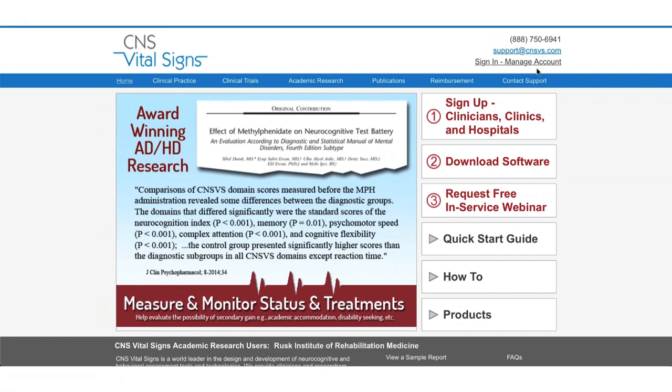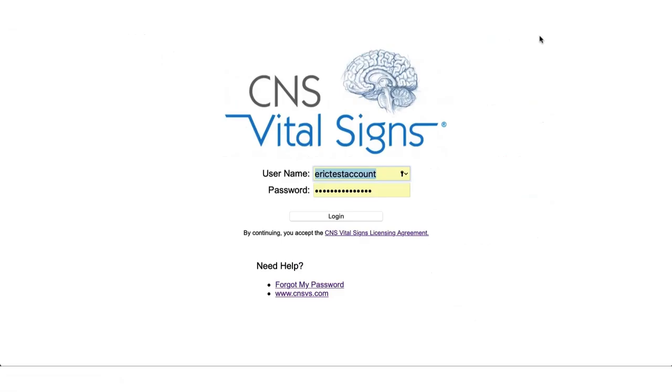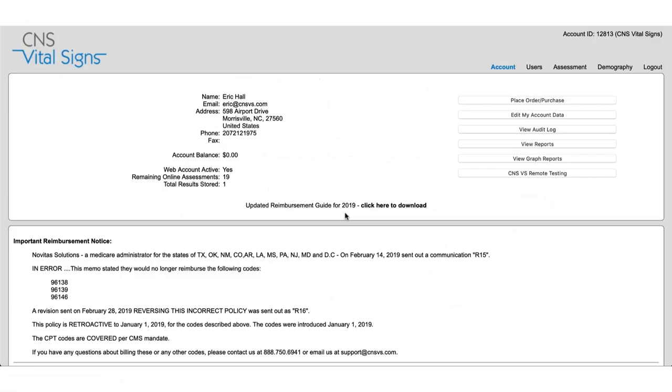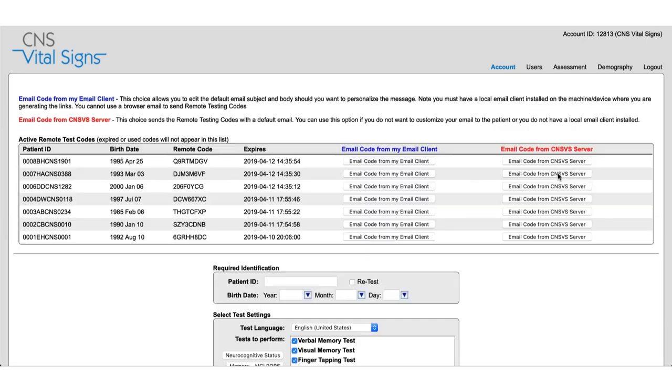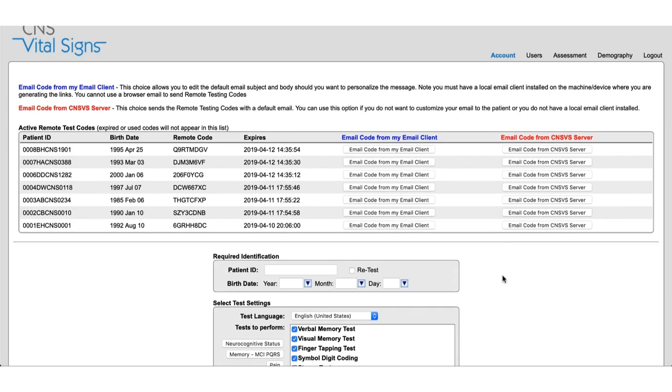So first we're going to start at the CNS Vital Signs home page. You're going to go and sign in manage account. Once you'll see on the right here we have a couple of different buttons to choose from. The bottom of which is CNS VS Remote Testing. So going in here this is how you access the remote testing page.